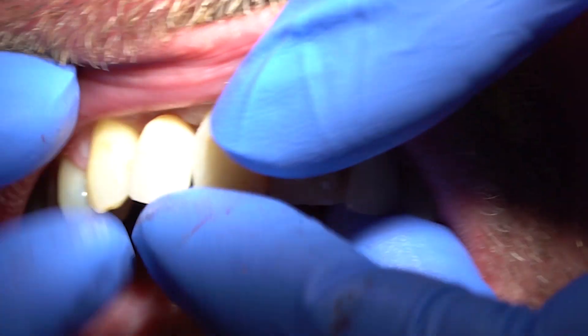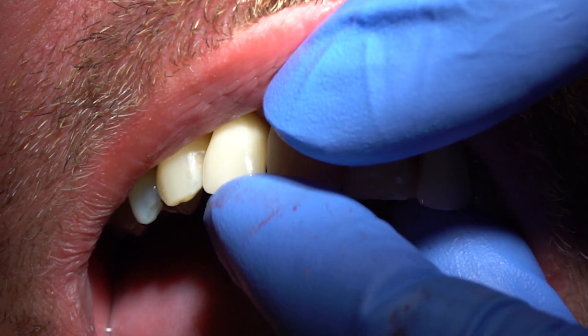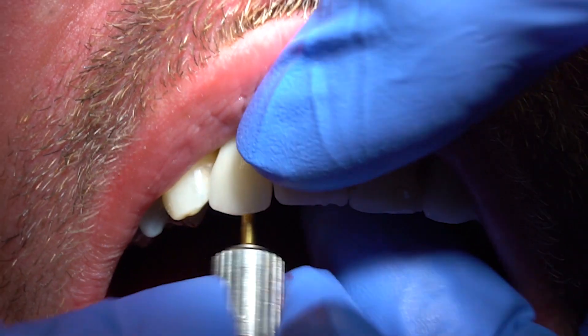So why wouldn't we just always use screw retained? Screw retained means without any glue — the actual tooth itself is screwed directly into the implant.